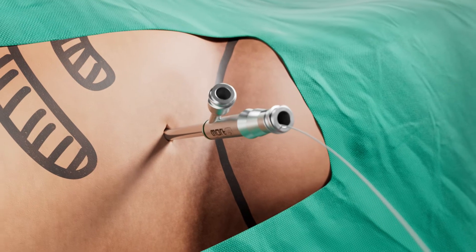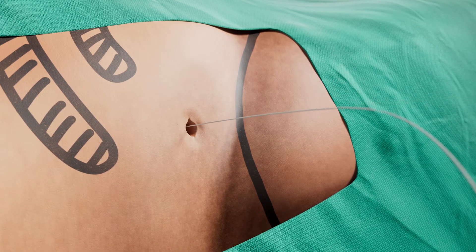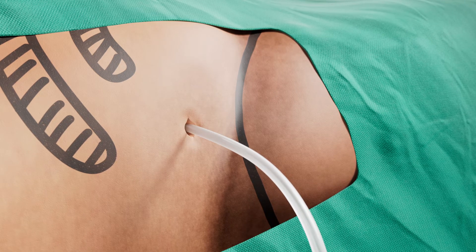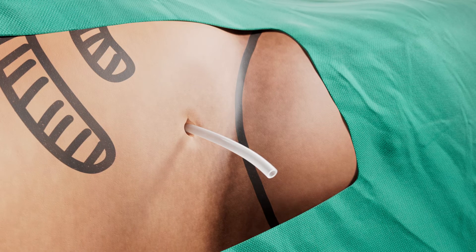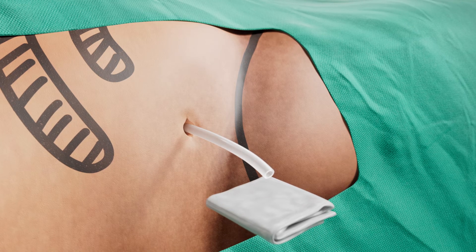After the end of the procedure, if needed, a guide wire is inserted into the kidney so that a nephrostomy tube can be placed. With the Ultra Mini PCNL procedure, you should be able to go home within a few hours due to the extremely small diameter of the tract.